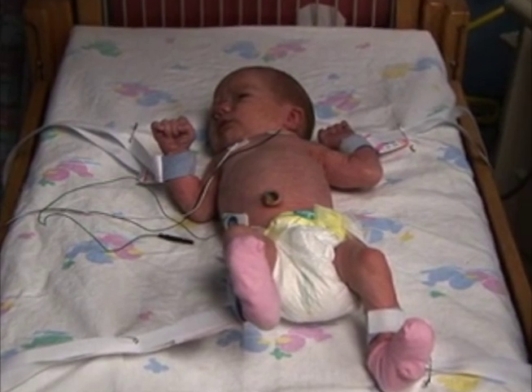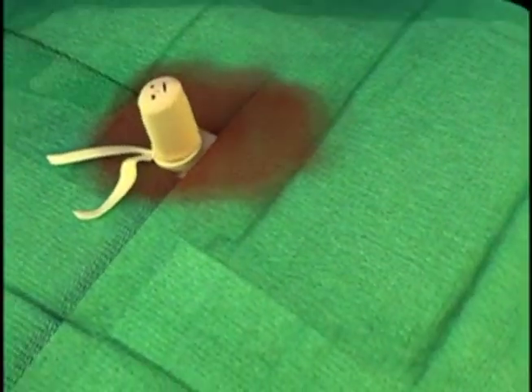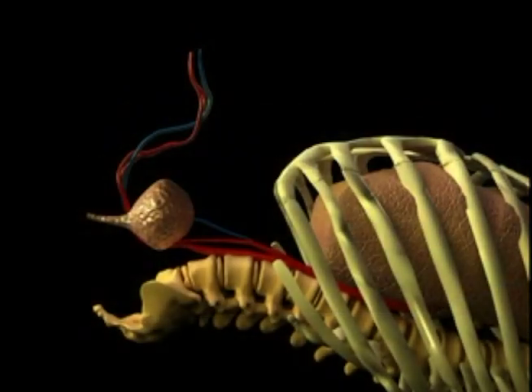The placement of umbilical catheters is an indispensable technique used to stabilize the condition of critically ill newborns. Proper insertion technique and knowledge of potential complications will improve the utility of these catheters in the newborn population.